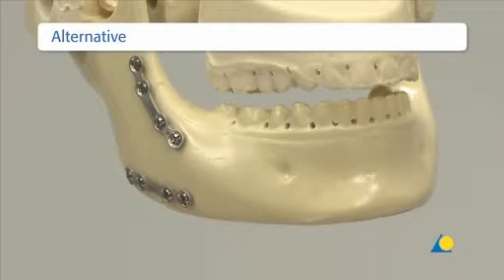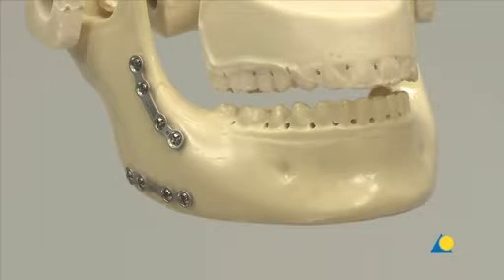One alternative is a 1.25 mm thick crescent plate along the lateral aspect of the upper border and a 1.0 mm thick mini plate along the lateral aspect of the lower border placed using the transbuccal instrumentation. Here, 2.0 mm locking screws were used. When this technique is used, a gap at the inferior border is not acceptable, as the plate at the inferior border will prevent the gap from closing.